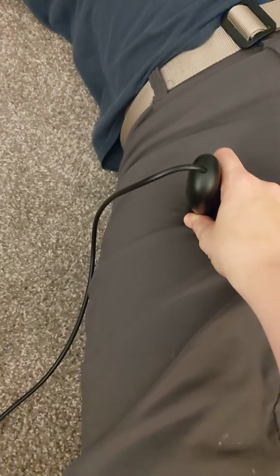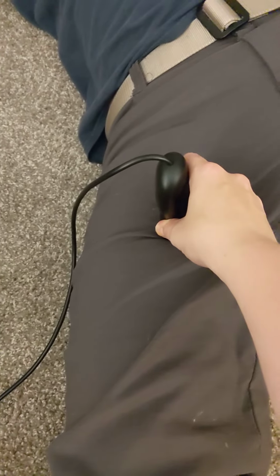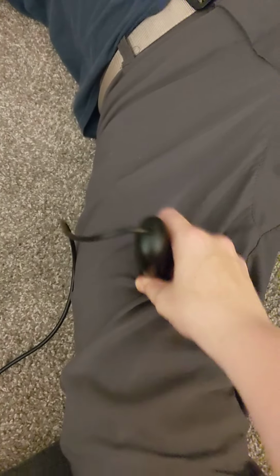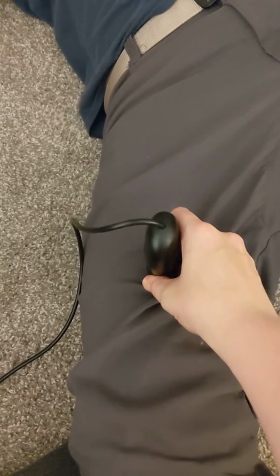Move past the bifurcation of the deep and superficial femoral and just go straight into the proximal section of the femoral vein. And again, put spectral Doppler on that. Move to mid, spectral Doppler, and distal with spectral Doppler. And again, just as distal as you can go before it kind of wraps and disappears on you.